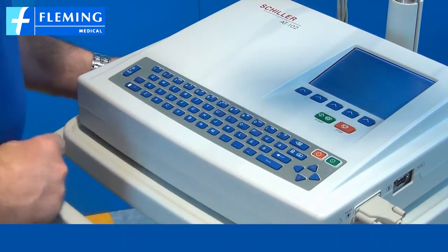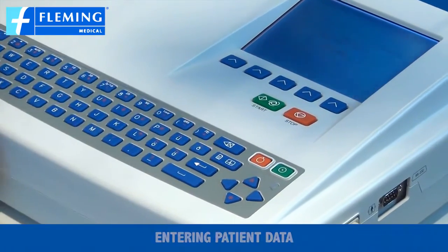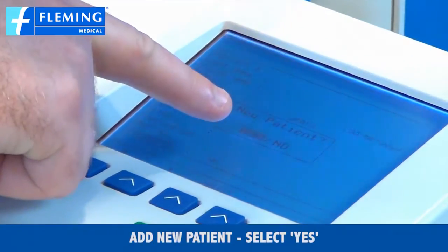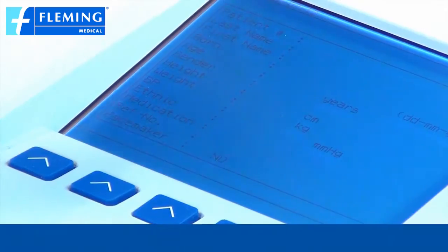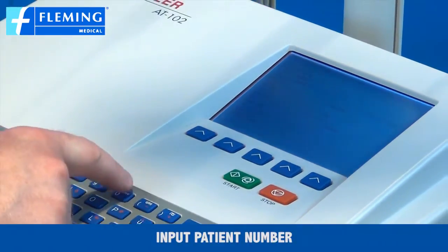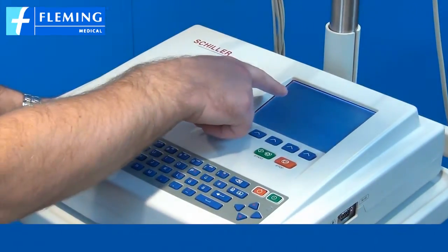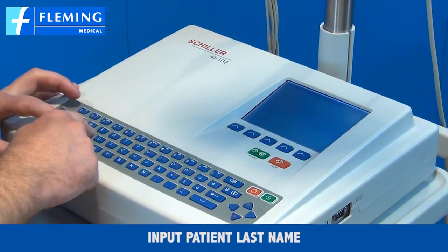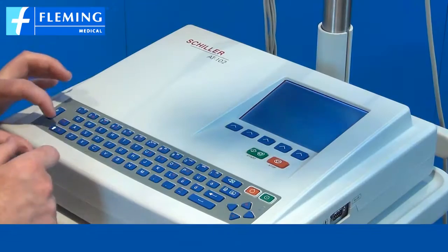How to enter patient data? We press the patient data button. You will be asked if you want to add a new patient — we select yes by pressing the enter button. Then you are prompted to put in the patient number. Pressing return allows you to put in the last name.